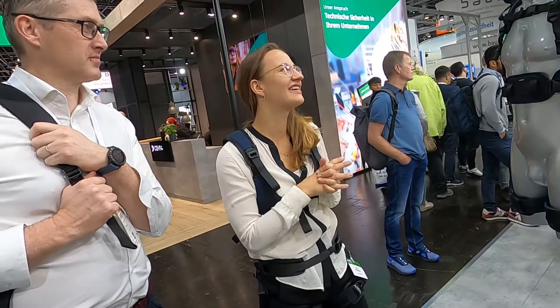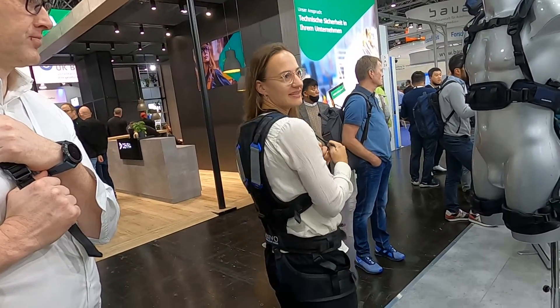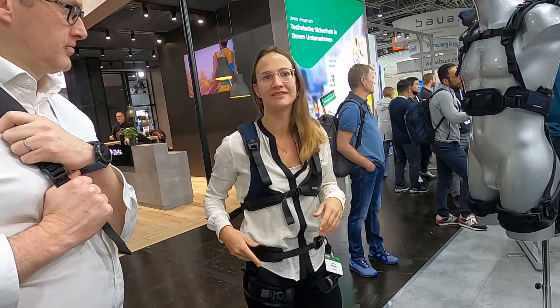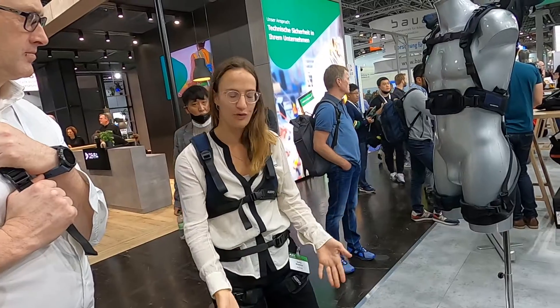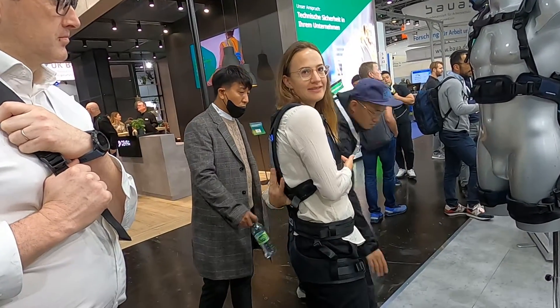We have three different products here, which are all passive. I have the lift suit on, a support exoskeleton which supports lifting from ground to hip level, with these elastic bands here at the back.